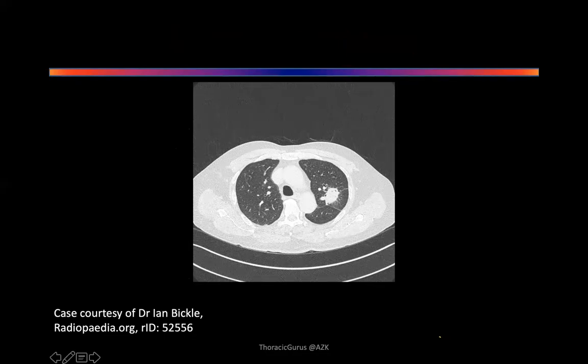Okay, this is a CT scan lung window showing a spiculated irregular mass lesion with variable densities, probably in the left upper lobe, and it is abutting the fissure. The surrounding lung parenchyma looks okay, except the spicules in the margins. That is probably the most important thing. Irregular. I wanted to talk about the spicules straight away because that is the key thing for this.